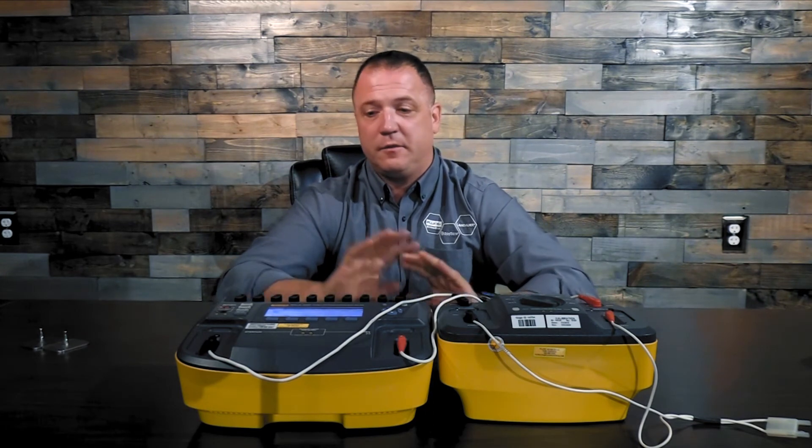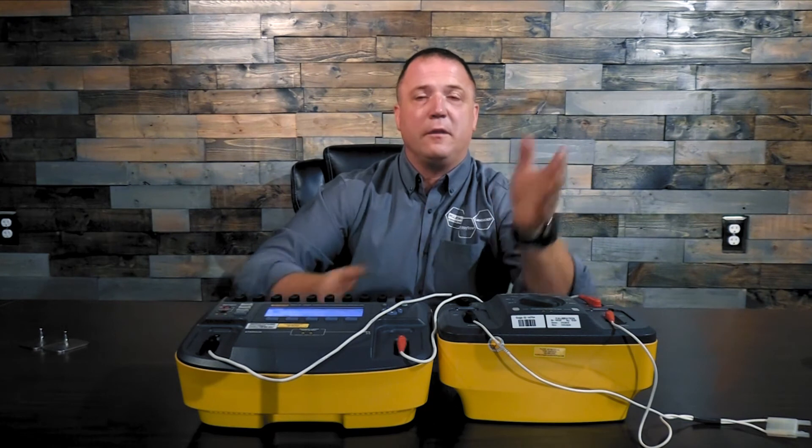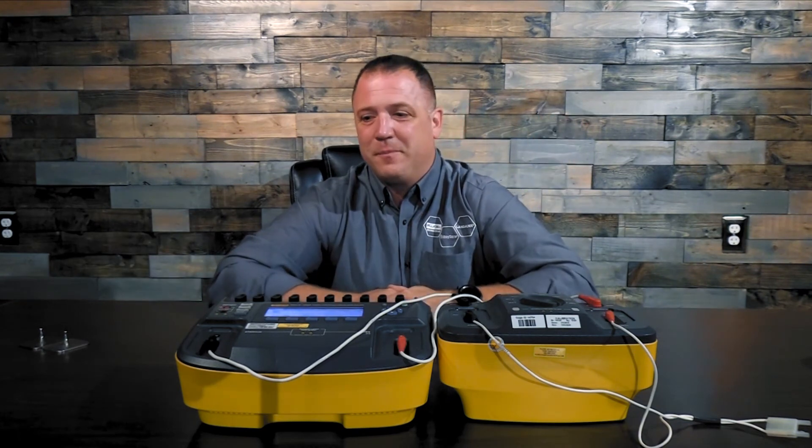It's that simple to use the 7010 loadbox to do your energy output tests. Just make sure whatever this is set at, this is set to match, and you go the whole rest of the way up through your scale. I thank you for joining us and learning about the 7010 loadbox, Impulse 7000, and transthoracic impedance.